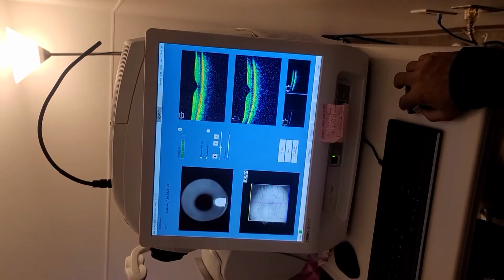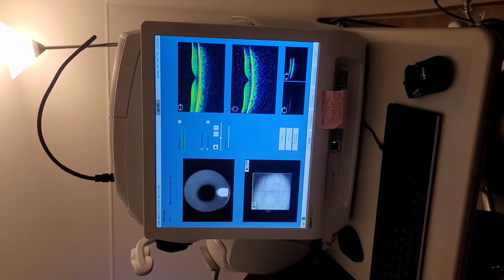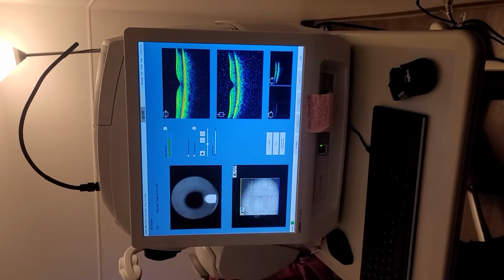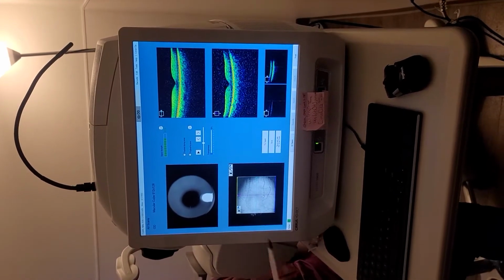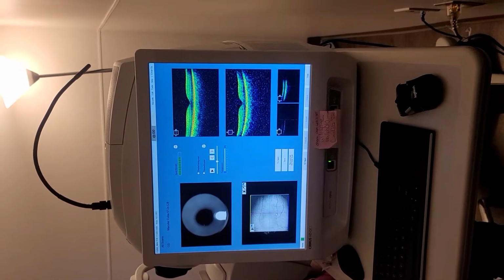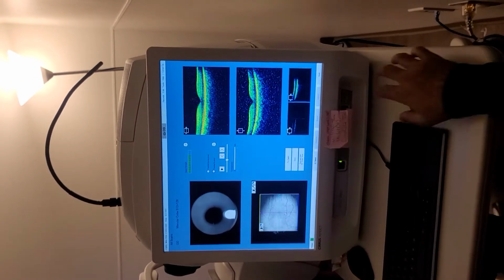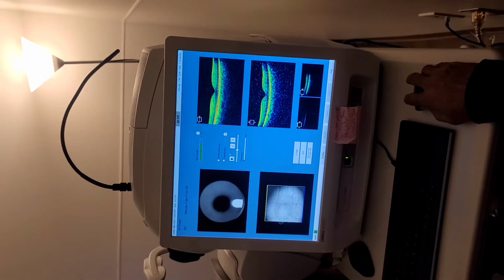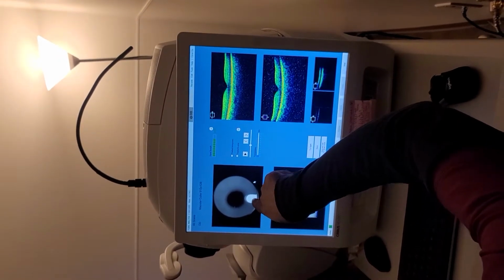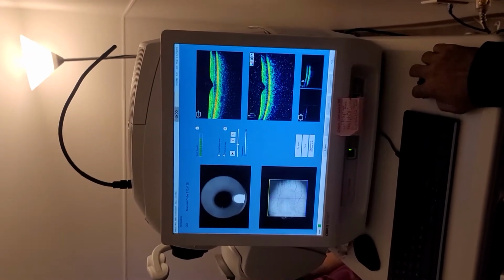Okay, I'm gonna tell you something too. Sometimes when you have the perfect image and you know it's good, it may not be as clear for you, but you know that you have this where it needs to be. That's okay. Because if that's good, then you go ahead and take it and see what your image is. So see how you have like 8 out of 10. That's good. That's fine. You're green. But what is this line? That's the light. Okay, now you can save this. Save it.